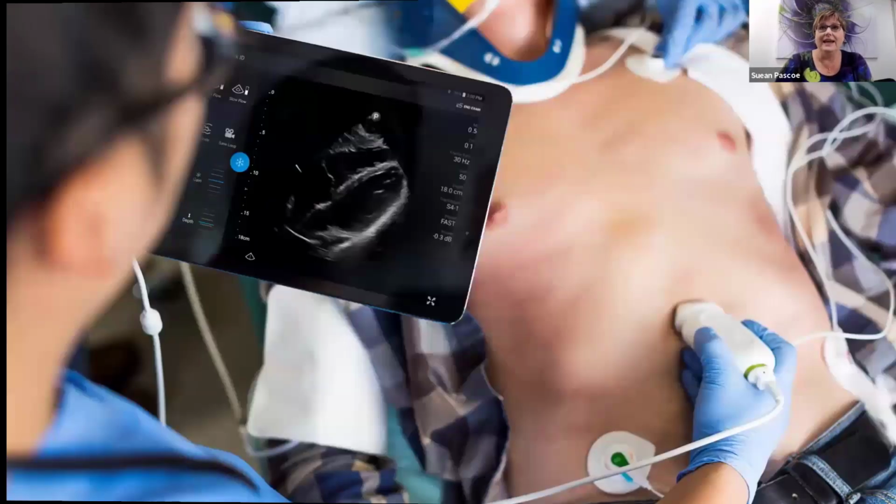Point of care is fast becoming a very low cost, easy tool. We can use handheld systems now, and even on the little handheld systems, we can make a lot of really crucial diagnoses so that we can get an answer very quickly. Even with the most basic machine, we can see quite a lot.